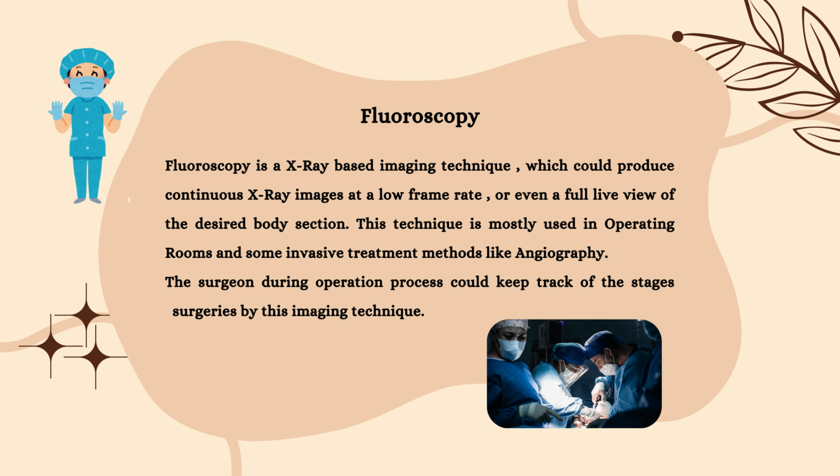And finally, fluoroscopy. Fluoroscopy is an X-ray based imaging technique, which can produce continuous X-ray images at a low frame rate, or even a full live view of the desired body section. This technique is mostly used in operating rooms and some invasive treatment methods.